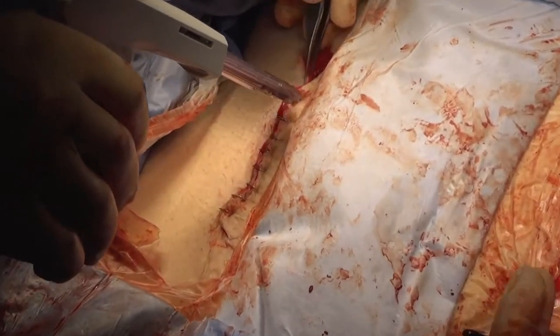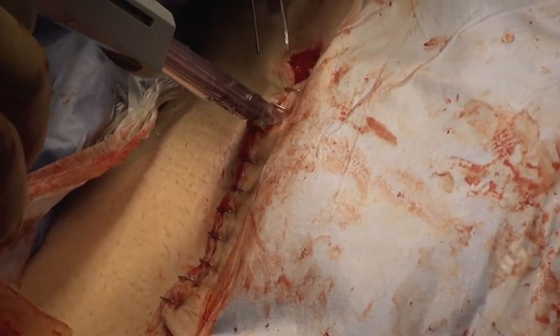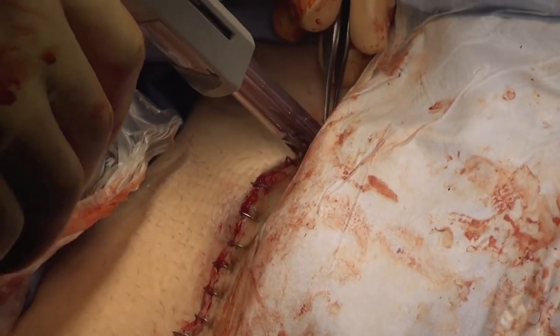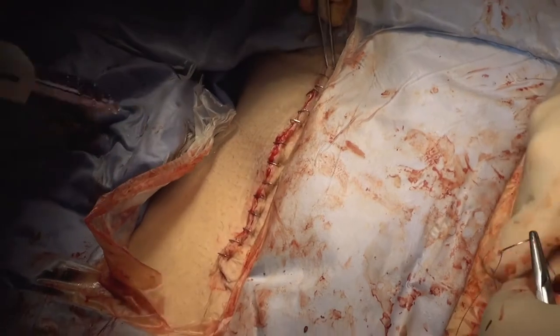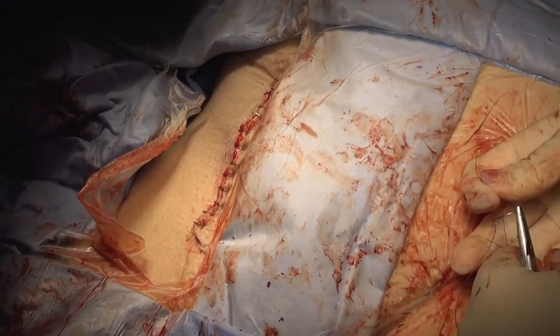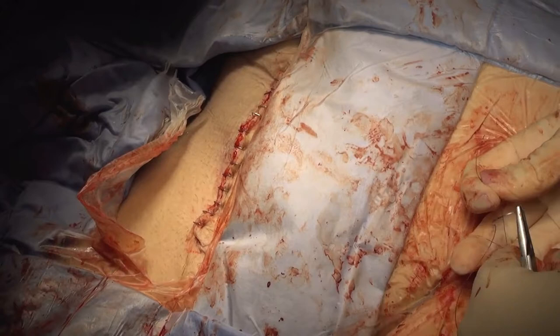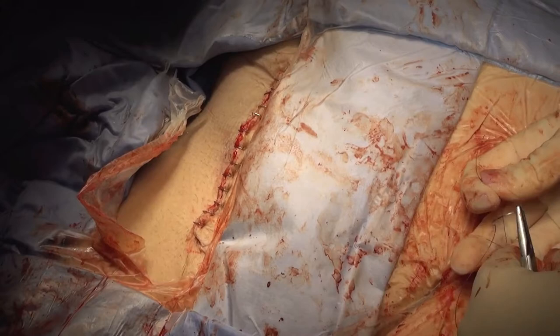Two layers of interrupted absorbable sutures are placed in the subcutaneous fat before the skin is closed with skin clips. The patient is then taken to the intensive care unit where blood pressure is monitored over the next few hours. If everything goes according to plan, the patient can be transferred to the general ward the next day where the focus is on mobilization. As soon as the patient is able to mobilize well, the patient can be discharged.